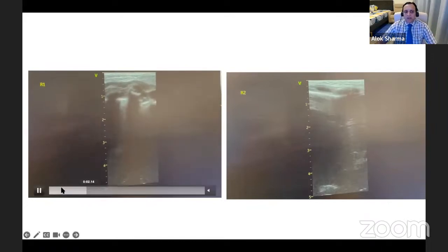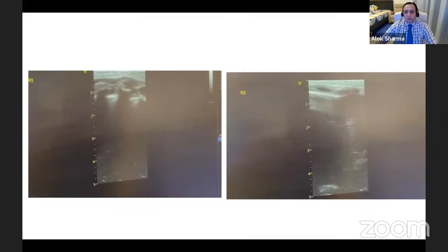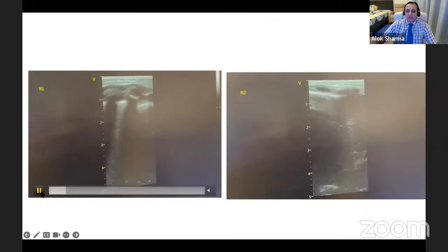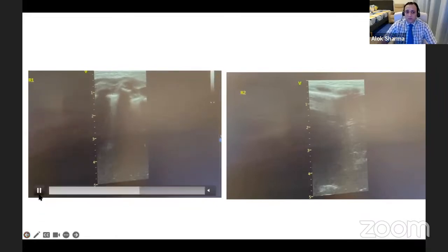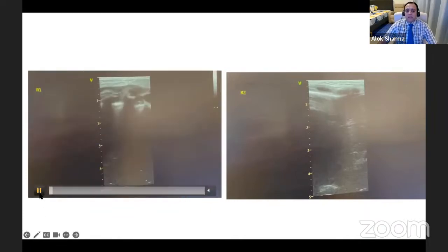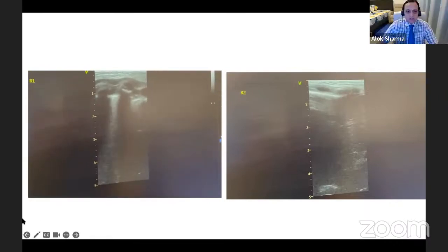So what you might have to do is a few more images for the R1. Starting at the top, using your hockey stick, just going down two spaces, you'll probably end up with two images for R1 and two images for R2. But this looks beautiful. You've got really nice sliding in R1, and a compact B-line coming down. A really nice compact B-line, with the B-lines having fused.